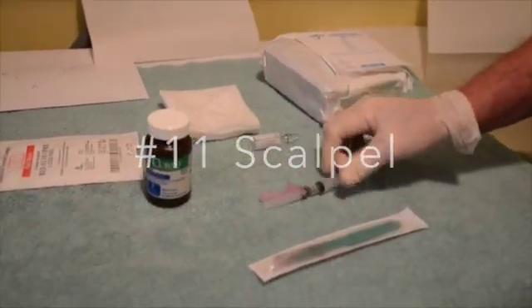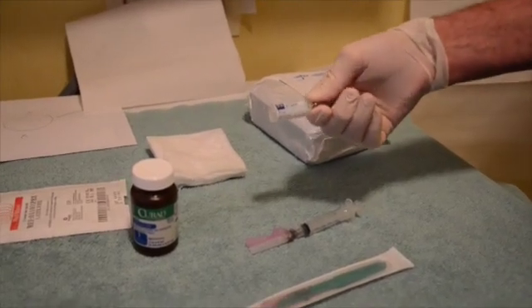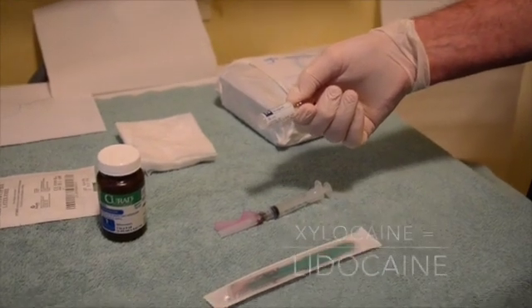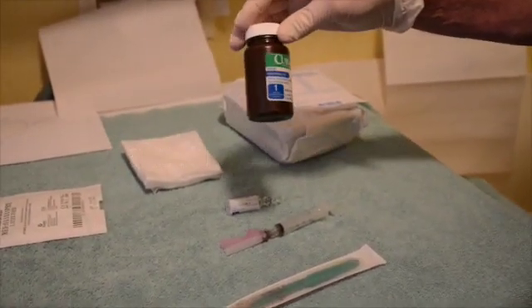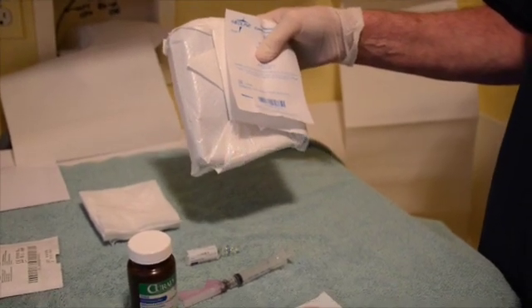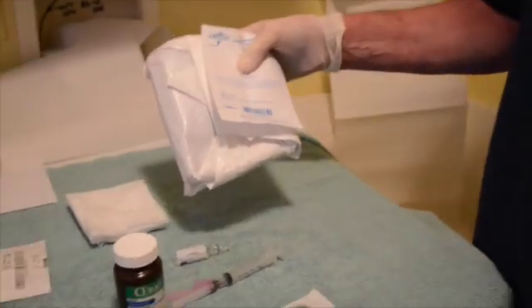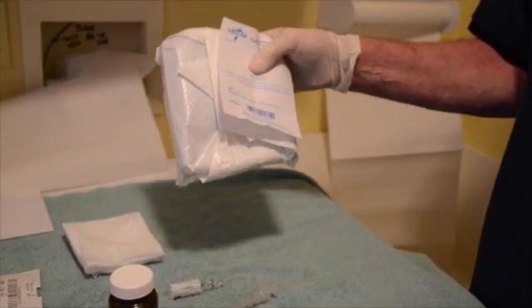We have a number 11 scalpel. We have a syringe, needle, and local anesthetic. Local anesthetic can be 1% xylocaine — you don't need 2%. Some people prefer to use it with epinephrine, but there's really no great advantage except that it lasts a little bit longer for pain relief. Packing gauze comes in various sizes; one quarter inch to a half inch is probably best. This is a general laceration kit — there's often no general I&D kit, although some hospitals have one with a scalpel and other equipment, but generally a laceration kit is probably best to use.